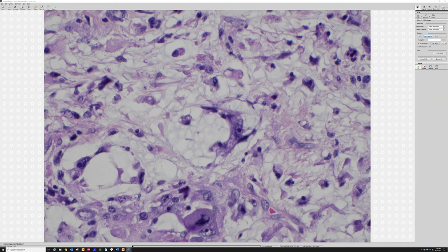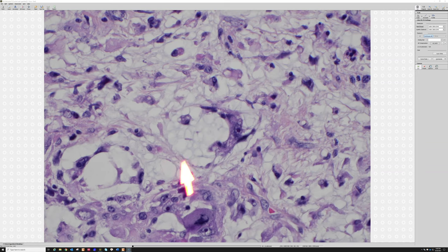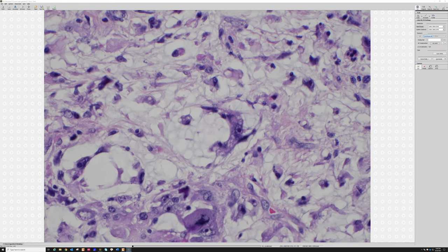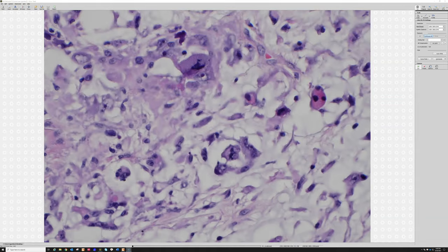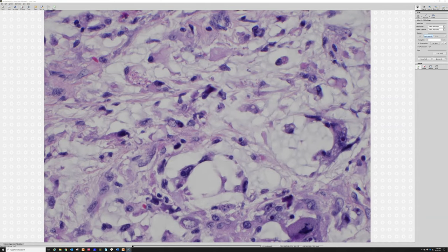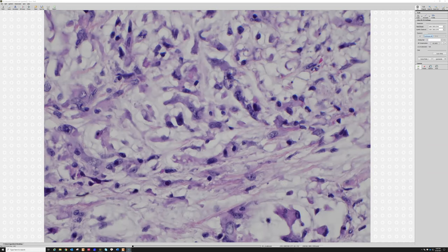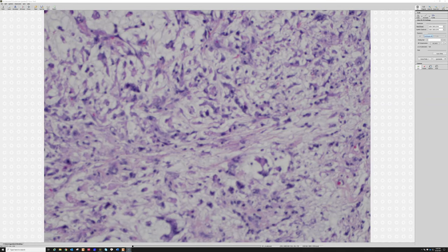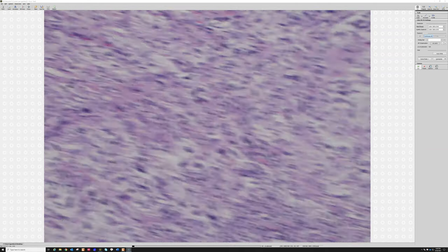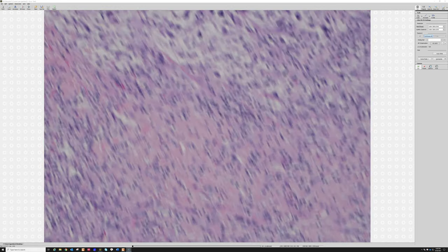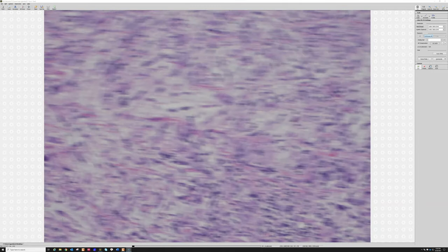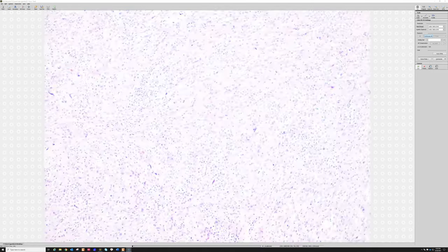One last thing: myxofibrosarcoma and myxoinflammatory fibroblastic sarcoma — another frustratingly similarly named tumor that can actually look quite similar — both have a tendency to suck up the mucin or myxoid material from the background and form blue loose vacuoles in their cytoplasm. These are called pseudolipoblasts. Do not confuse these with true lipoblasts: if this tumor had a true lipoblast, I would call it a pleomorphic liposarcoma with myxoid change, not a myxoid liposarcoma. I have a liposarcoma 101 video linked below.